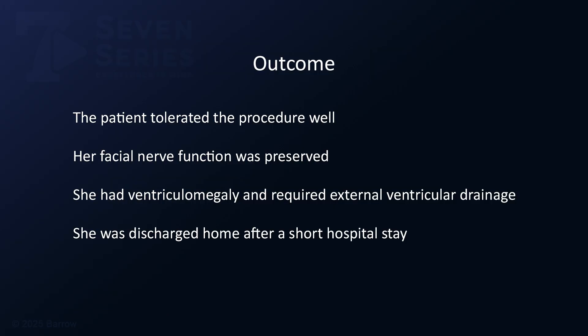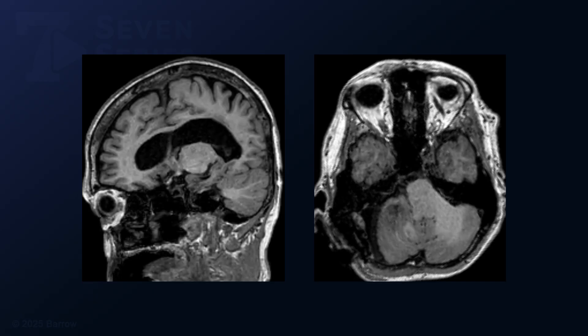The patient tolerated the procedure well. Her facial nerve function was preserved. She had postoperative ventriculomegaly which required an external ventricular drain for several days. She was discharged home after a short hospital stay. Her postoperative MRI is shown here and there is no evidence of residual other than what was left on the course of the facial nerve.